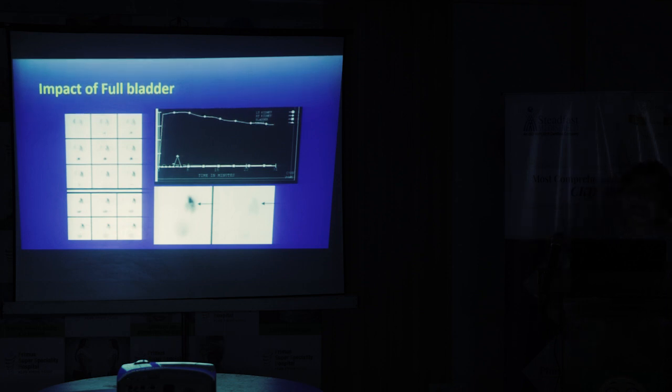And that is why it is very important to take an image at the end of the dynamic study, which is a post-void image. Because so many times, the functional stasis of tracer in a dilated pelvis will clear out once you decompress the urinary bladder. Sometimes in patients who've got a neurogenic bladder or who've got a vesico-ureteric reflux, you would actually place an indwelling catheter in the bladder, keep it on flow, and then do the renal study to get an accurate assessment of the renal function.